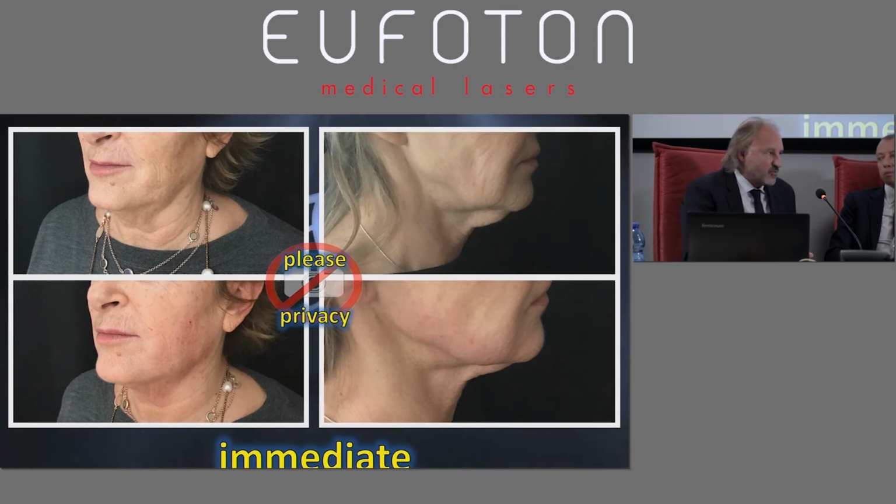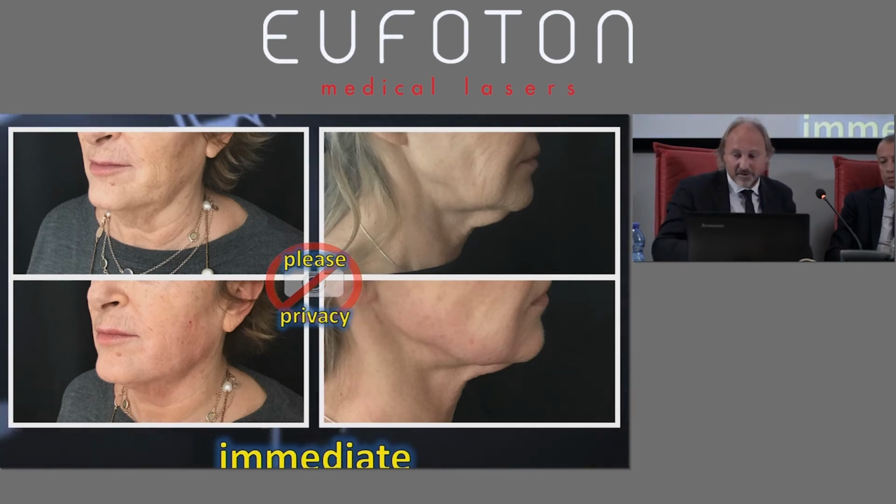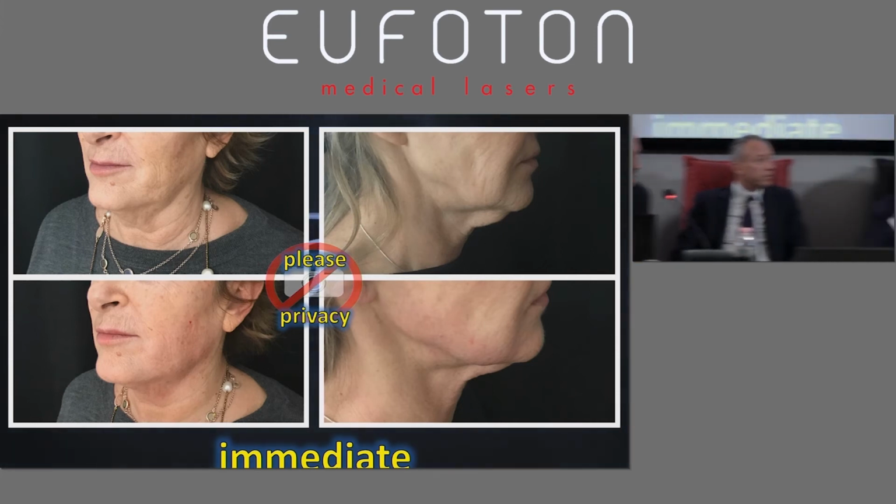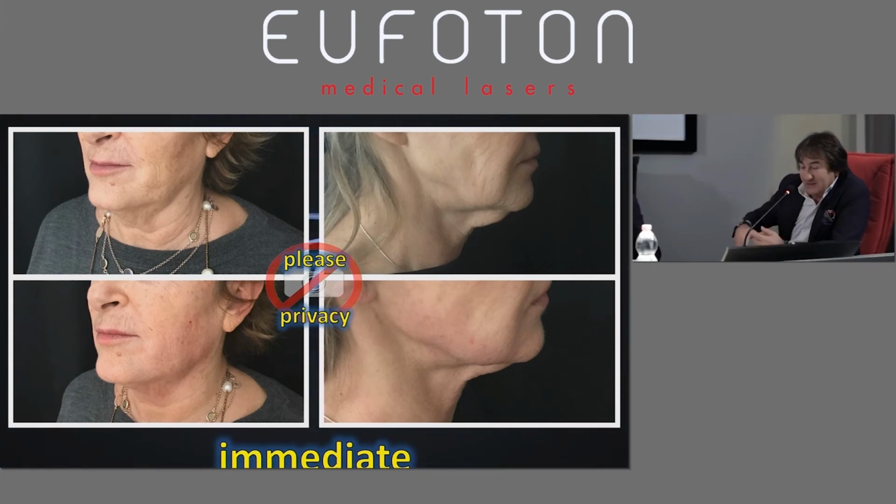So we speak of the wavelength which is used by the non-ablative fractional lasers. So we speak of thermal remodeling, regeneration. This actually does the same thing as the non-ablative fractional laser, which is found in the machine kit. I also use the fractional laser a great deal, in addition to Endolift, also combined with biostimulation, so a strong impact. For the lower part of the neck, I finish this off using the fractional laser.